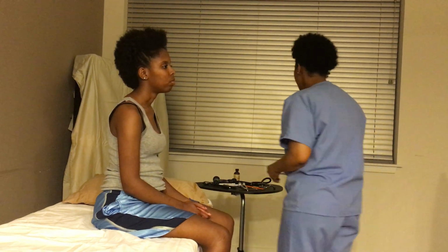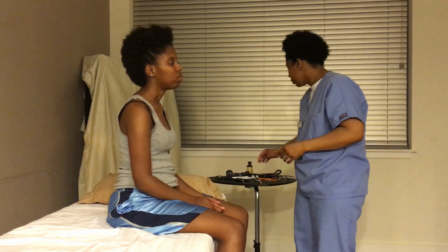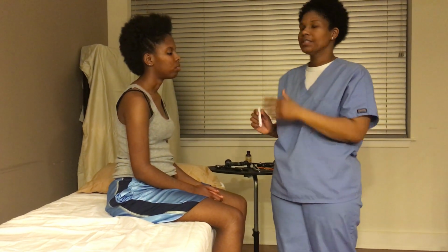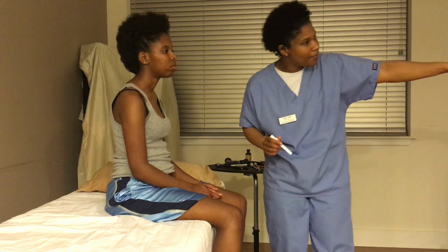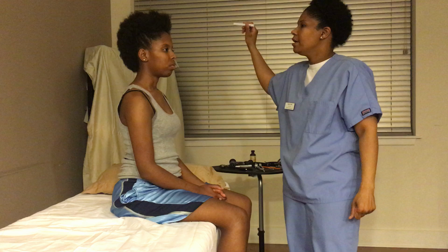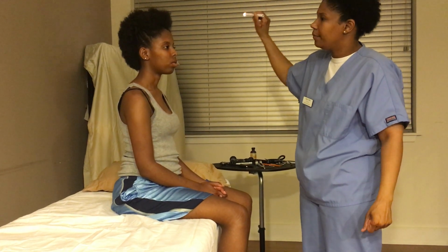Perfect. Okay. We're going to check the corneal light reflex test. I want you to focus on that orange bucket there, and I'm going to shine the light immediately into your eyes.